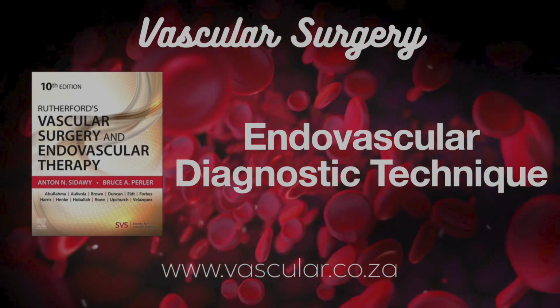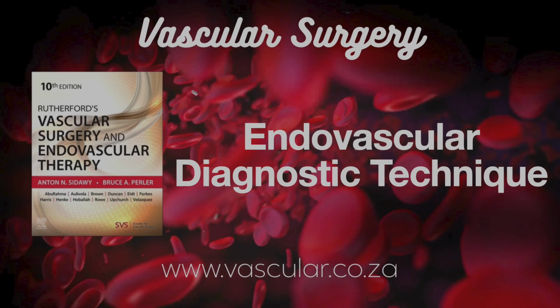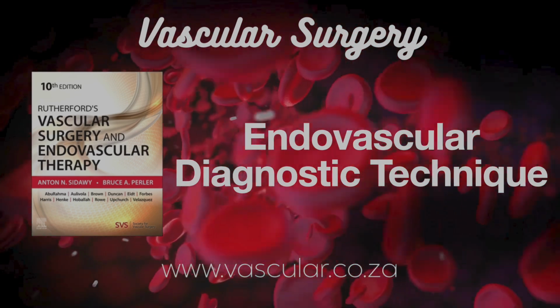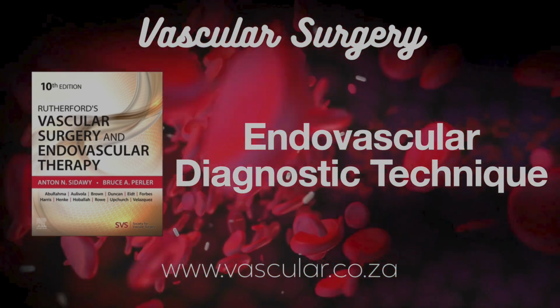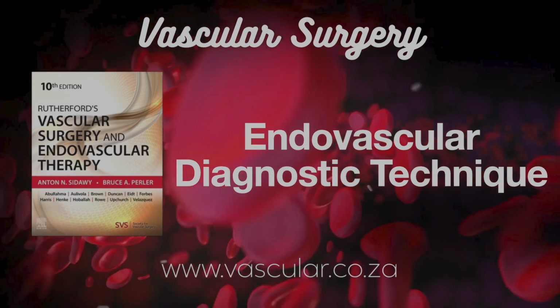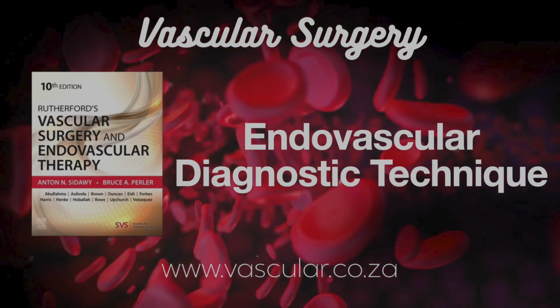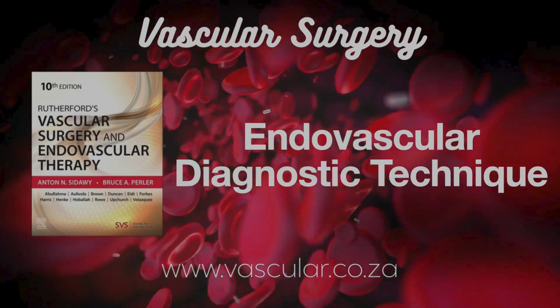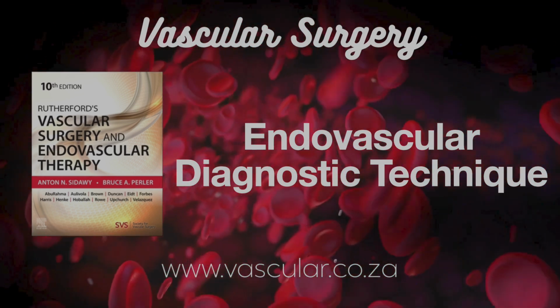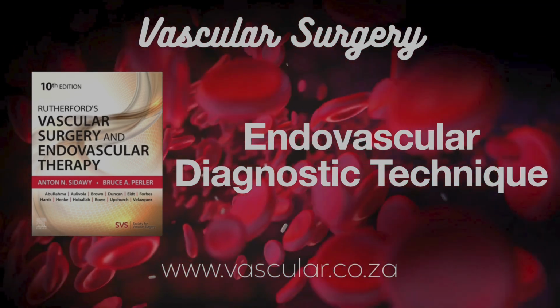Okay, beyond the entry point, what about problems caused by the wires or catheters navigating inside? Yeah, mechanical injury to the vessel wall: perforation, poking a hole, or dissection, tearing the layers of the wall, can lead to clots forming and embolizing downstream. How to prevent that? Constant fluoro monitoring as you advance is key. Choose the right size and type of wire and catheter for the vessel, and don't force things. Be especially gentle in delicate areas like renal or mesenteric arteries.